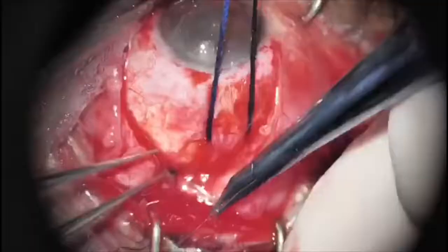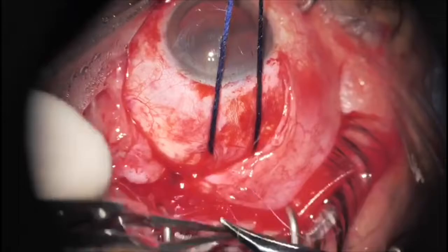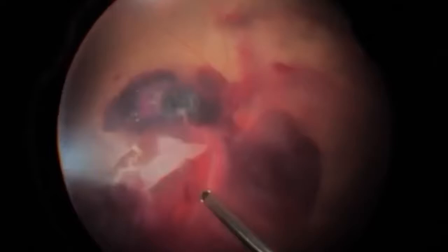Regarding the repair of a laceration of the globe, first the structural integrity of the globe must be restored, providing a watertight closure of the wounds. In general, removal of an intraocular foreign body is recommended at the same time as the repair of the entry site, or soon afterwards.